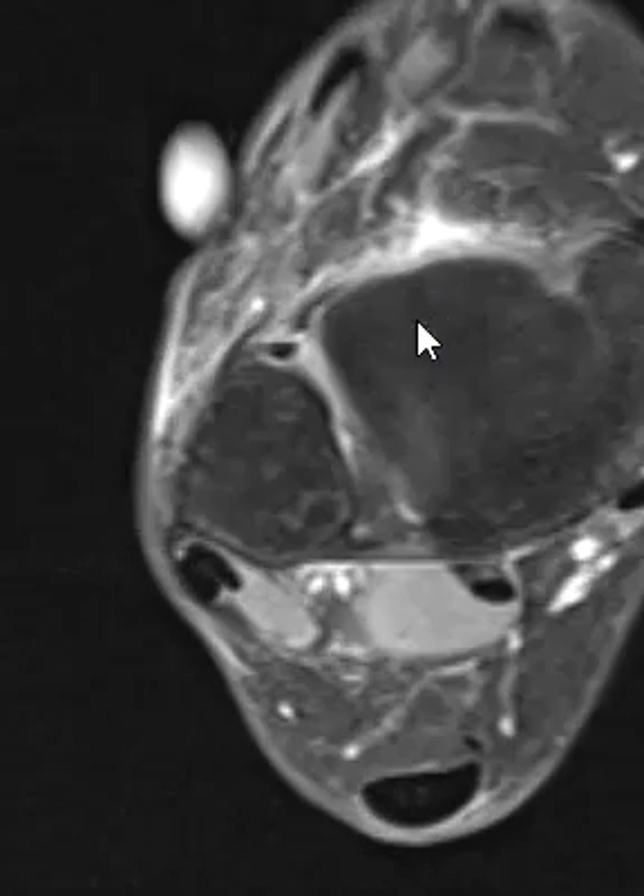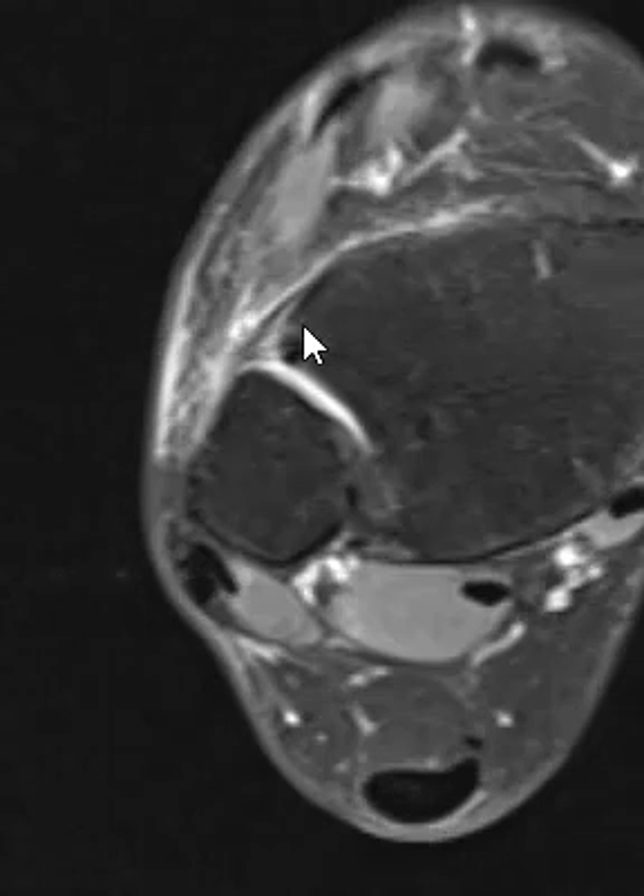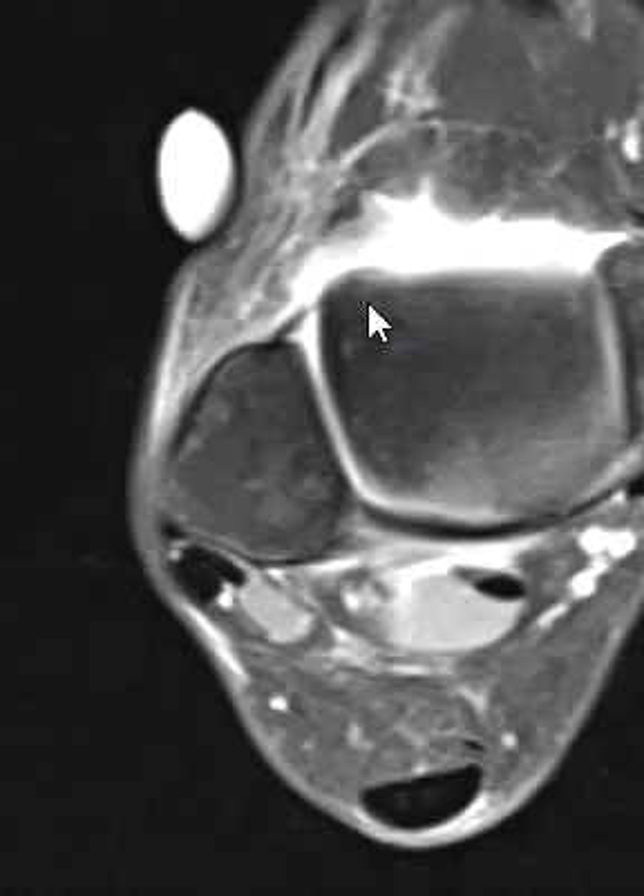If we come up here to this other one above the joint, this is the tibial fibular ligament. It's not quite normal — it looks like it has a sprain of the anterior tibial fibular ligament as well.